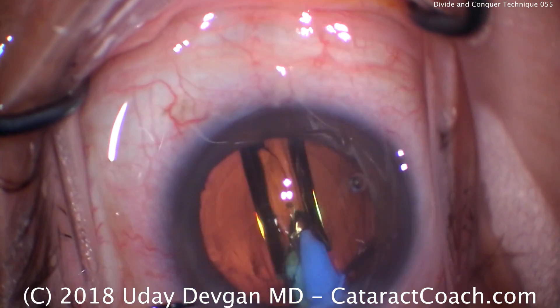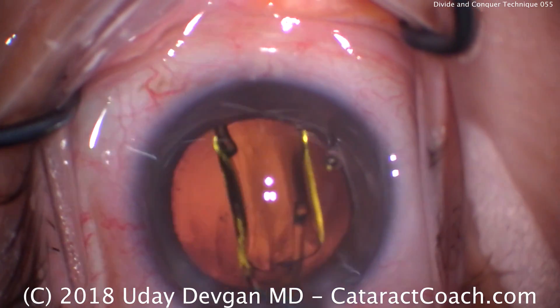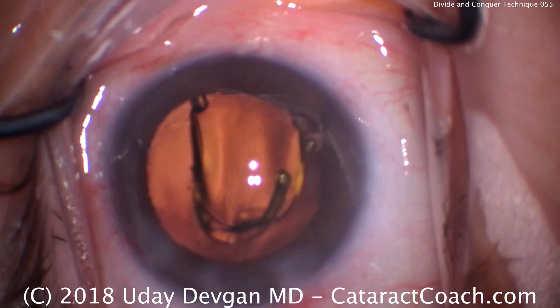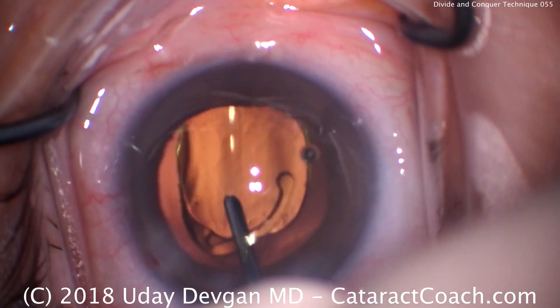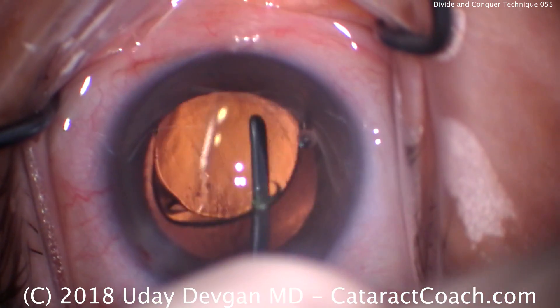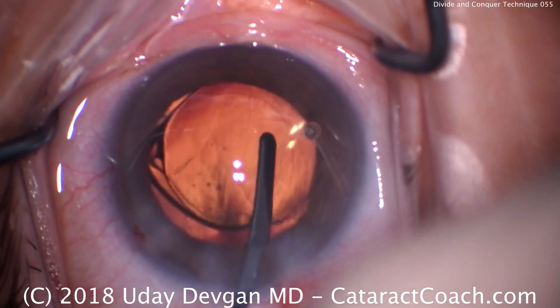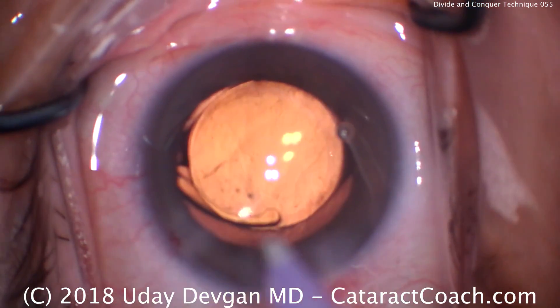There's the optic, and now we just need to dial the lens into the capsular bag. The AC is shallow here because of lack of viscoelastic, so I'm going to use the spatula to get above the optic — there we go — and we'll get this to open up appropriately and ensure that both haptics and the optic are completely within the capsular bag.